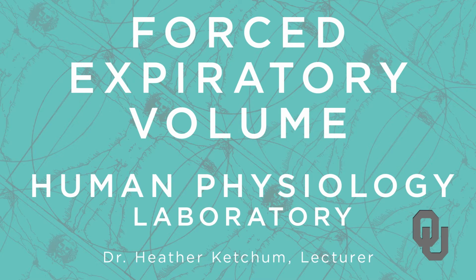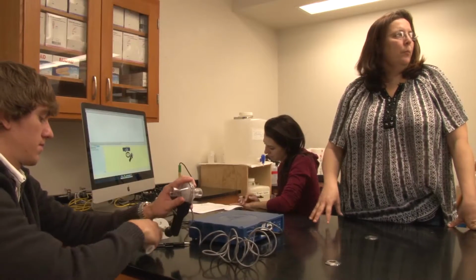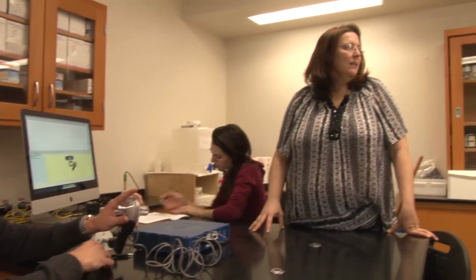So the forced expiratory volume is a little bit different than the normal vital capacity and things that we measure. In a normal spirometry test, which was what the first lesson was, you can measure the normal lung values, but it doesn't really give you an idea of how fast the person can move air in and out. As we know, when you have an obstructive airway disease, it's going to affect the speed at which you can move air in and out.